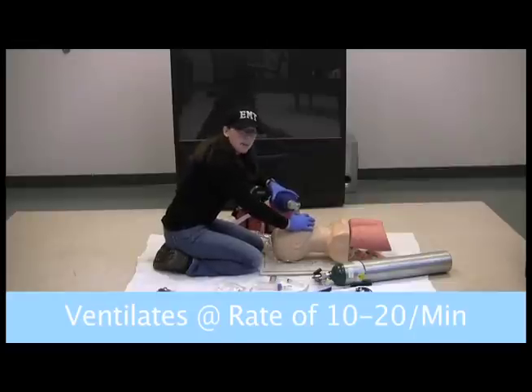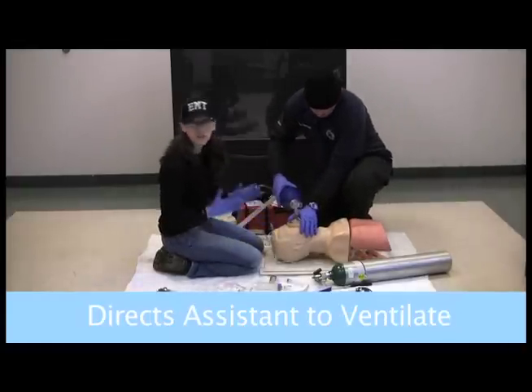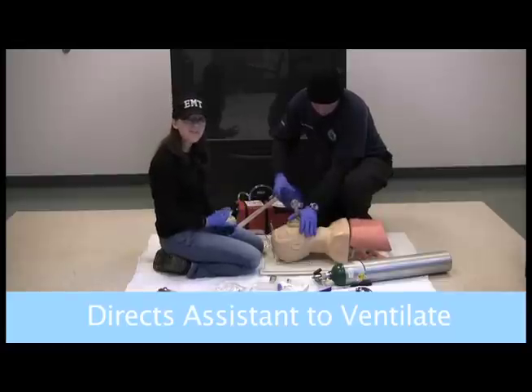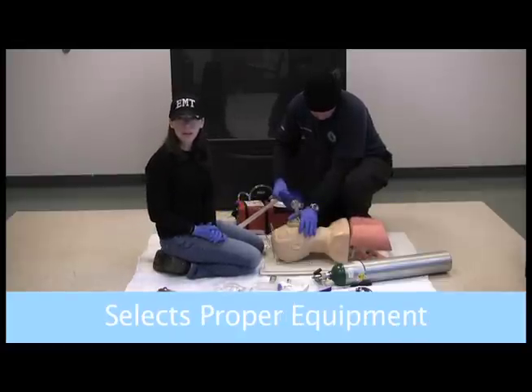I can continue at once every five to six seconds. At this point, I have contacted medical control and they have ordered intubation. I want to go ahead and get my rescuer here to take over ventilation. He'll continue at once every five to six seconds, and this is the perfect time to check my equipment.